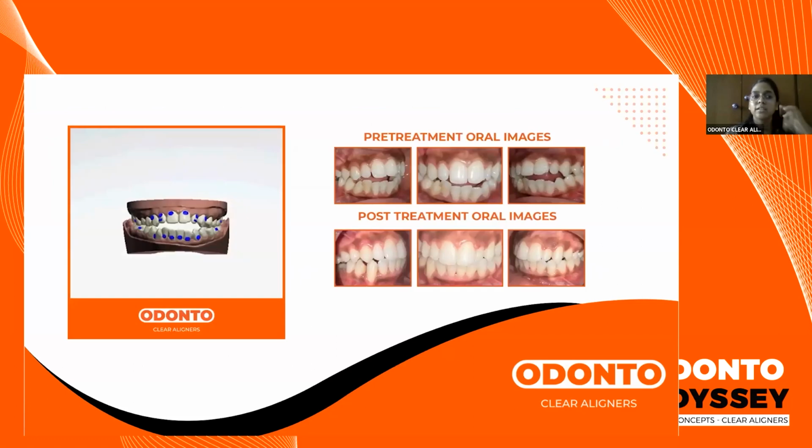So one of the first cases that we will start with, we can see that there is an anterior open bite. The relation is fairly a class 1 relation, and there is mild crowding in the lower anteriors, and the upper arch is fairly well aligned, but our main concern is the open bite which is there. So in such a case, we would want our posterior occlusion to be quite stable. We would not want to play around with it, though we will have some amount of intrusion to aid in closing the bite.